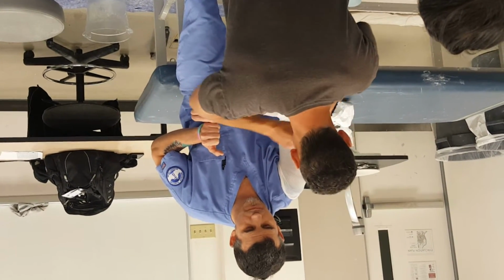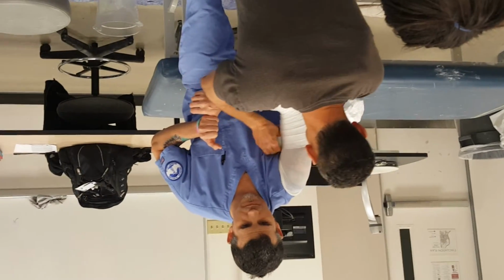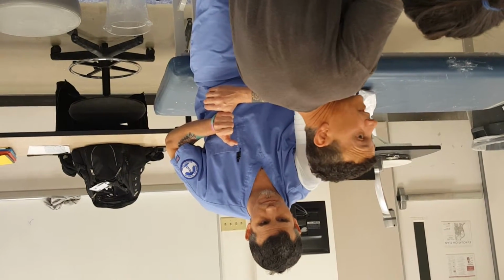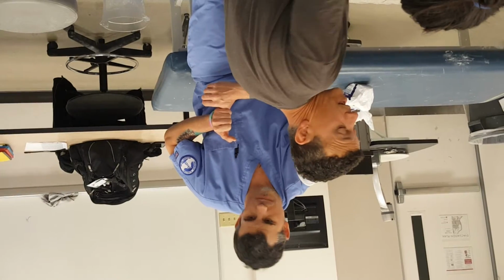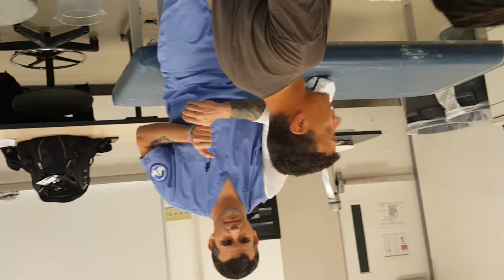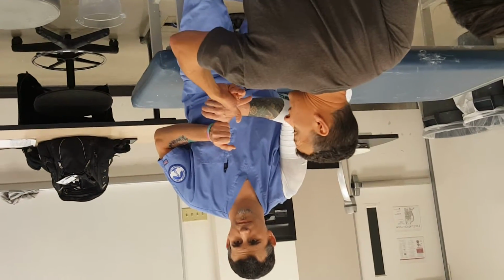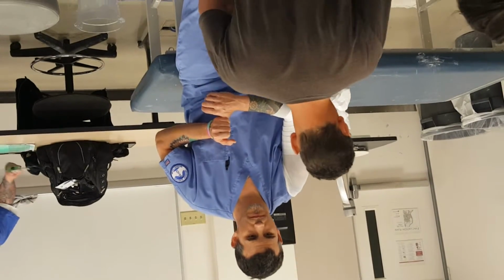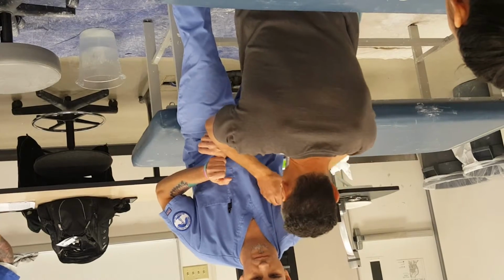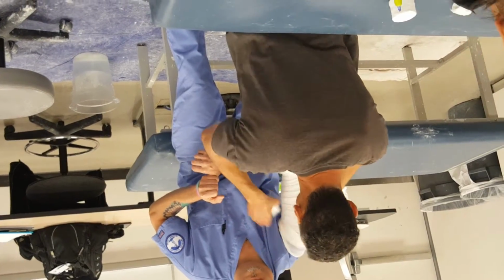You're going to treat pretty much mid to distal to proximal third humerus fractures. They could be mid-shaft, they could be spiral, they could be whatever way you can fracture a humerus, you will treat it in this. You will see a lot more of the humeral fracture braces, and you will see this. You got it? It's easier, more convenient. This is a one and done cast, too. I get a 50% overlap all the way up. Right here, I'm going to start going up towards the AC joint.